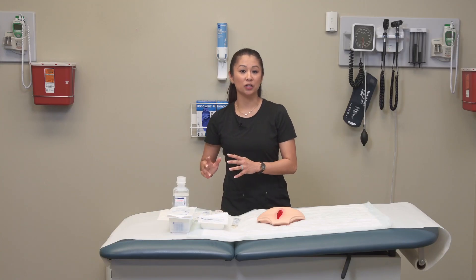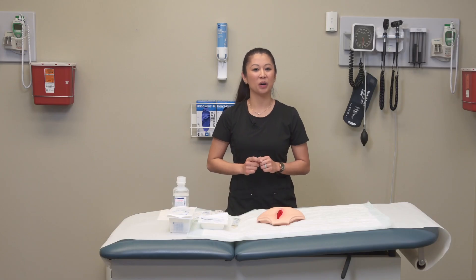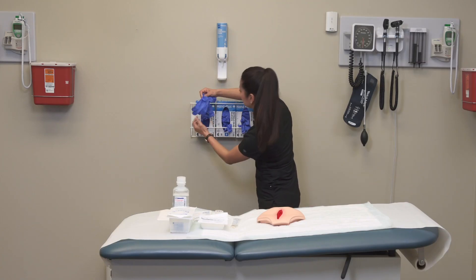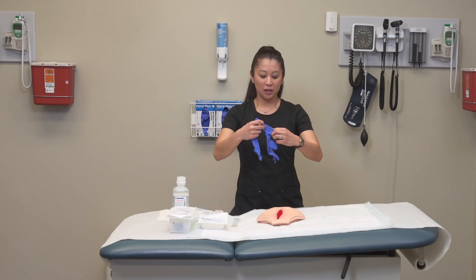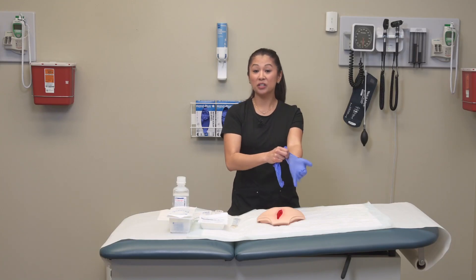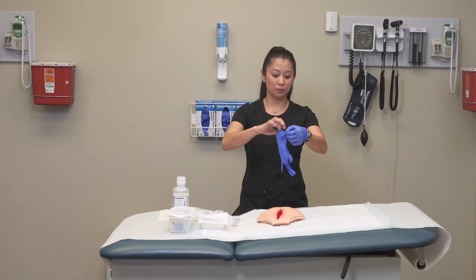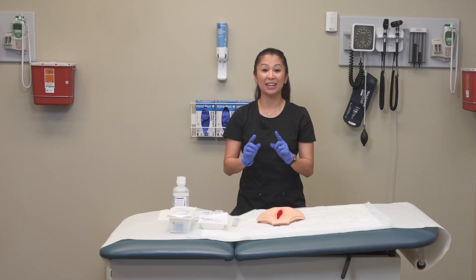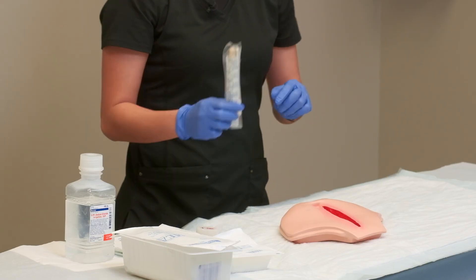Once irrigation is complete, remove gloves, perform hand hygiene, and put on clean gloves for the swab. Double-check that you're in the right patient's room and confirm name and date of birth. Also make sure you're using the right swab for the right lab test — your lab department is a great resource for that.